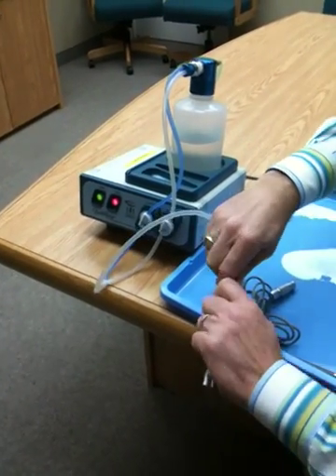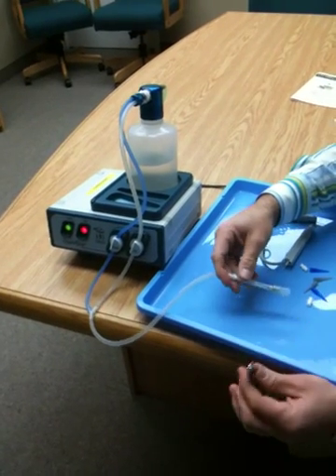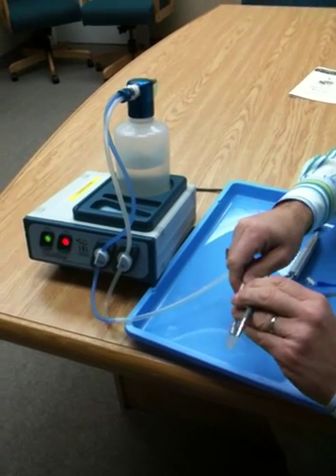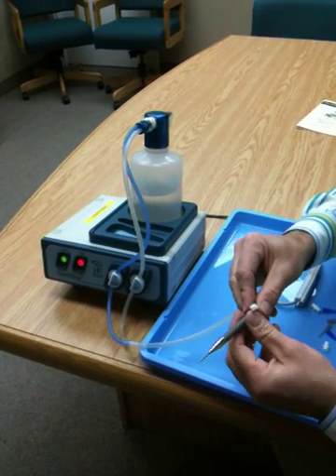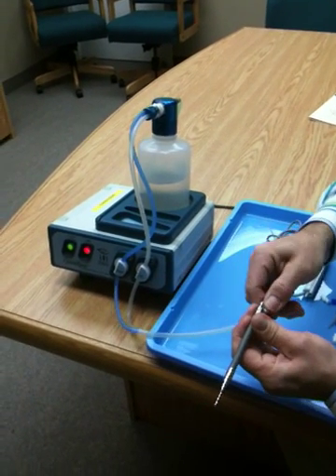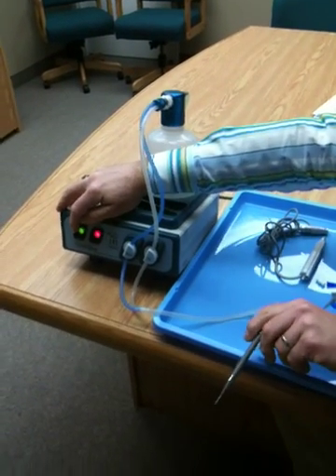It works in the same operation. If you're trying to clean something with a very small opening, like an IA handpiece or an IA tip, there are adapters that will fit into here. You will want to override the automated cycle in very quick succession because of the small opening.